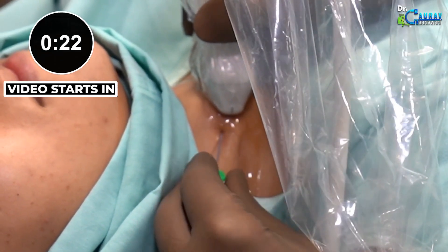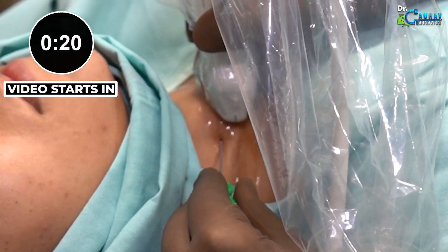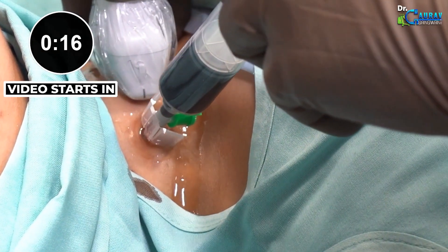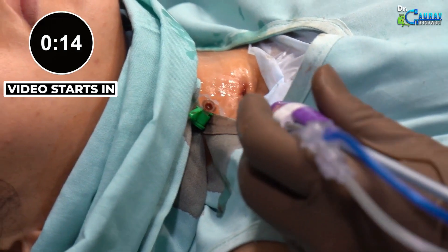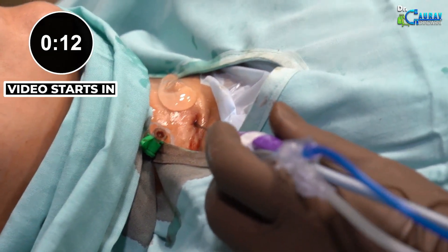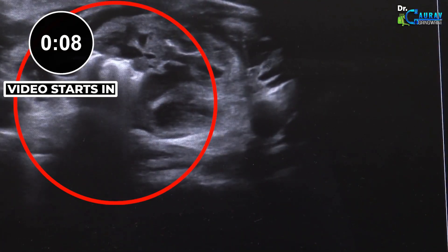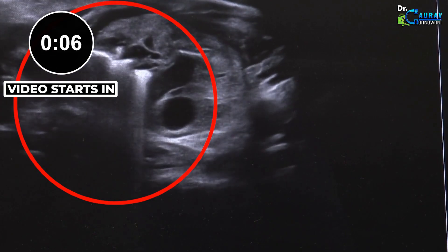First, we inserted the cannula and completely aspirated any old blood or liquid that was present in it, meaning we removed it from the body. We then started to burn the nodule. First, we will burn the base layer. The white cloud you see is the vapor cloud forming from the burning of the solid part of the nodule.